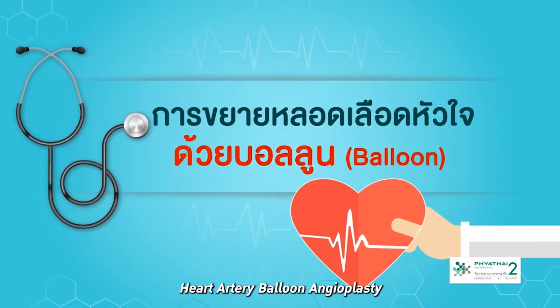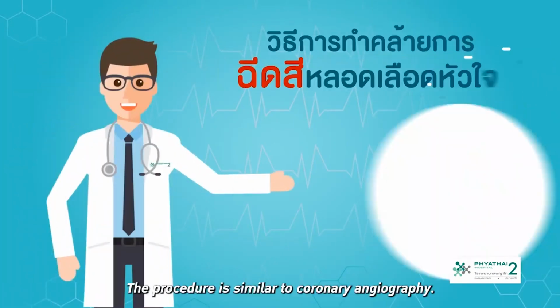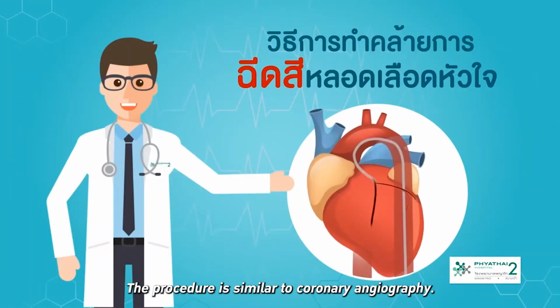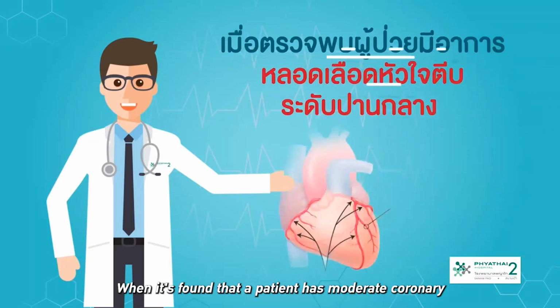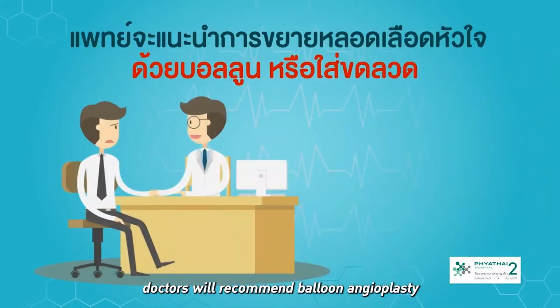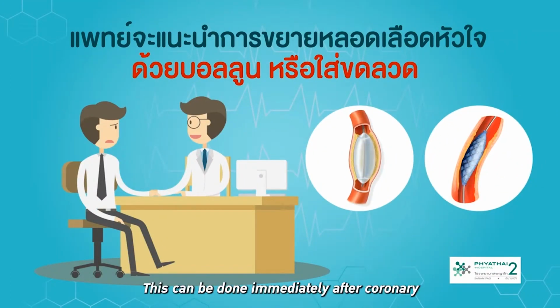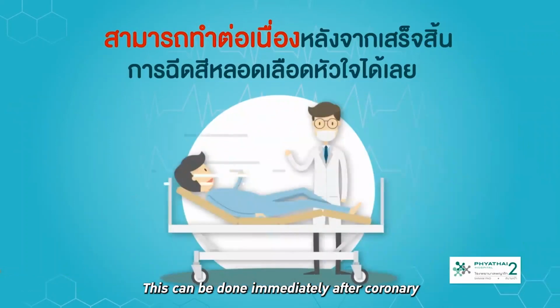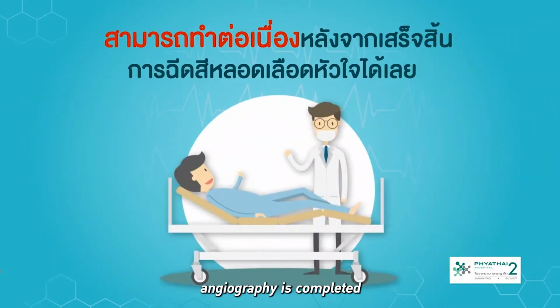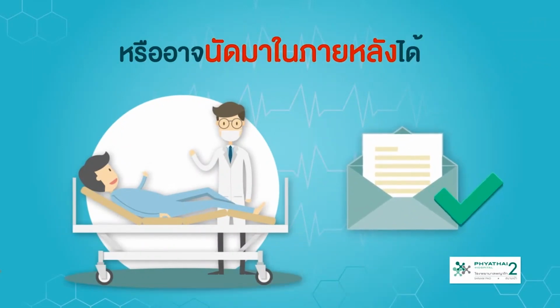Heart artery balloon angioplasty. The procedure is similar to coronary angiography. When it is found that a patient has moderate coronary artery constriction, doctors will recommend balloon angioplasty or stent placement. This can be done immediately after coronary angiography is completed, or it can be scheduled for a later date.